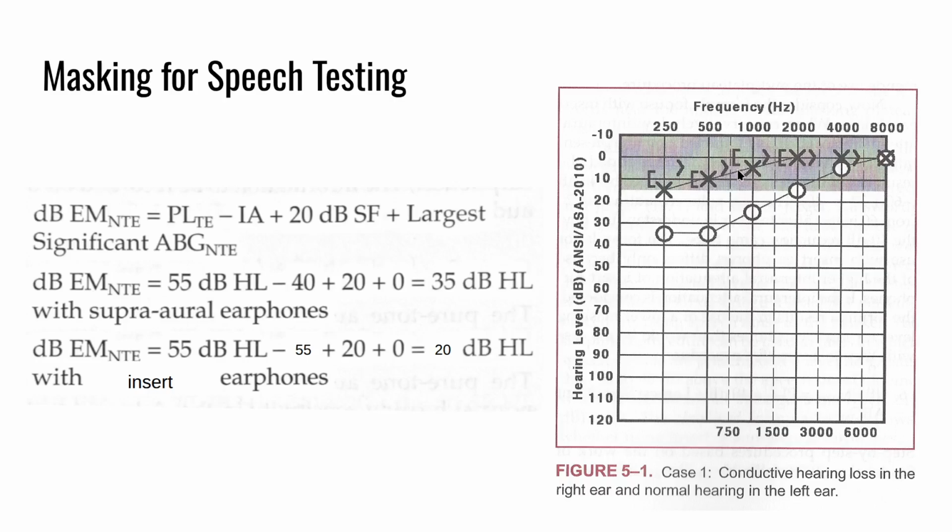Really 5 is the largest air-bone gap that I'm seeing. But in here they calculated it, for some reason they have 0 as the largest air-bone gap. But in any case, it's not a very significant difference either way. Maybe the key terminology here is largest significant air-bone gap. Air-bone gaps 10 dB or less are not considered significant. That's likely why they're factoring it out as 0.